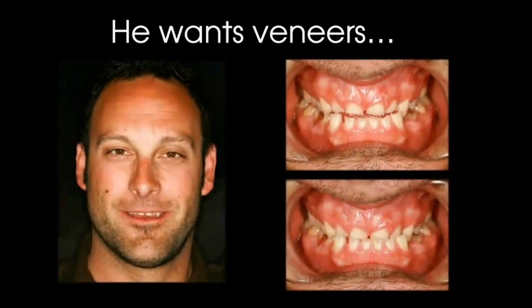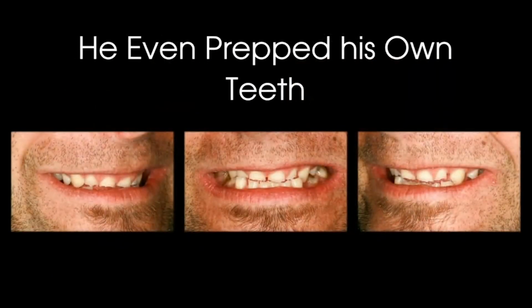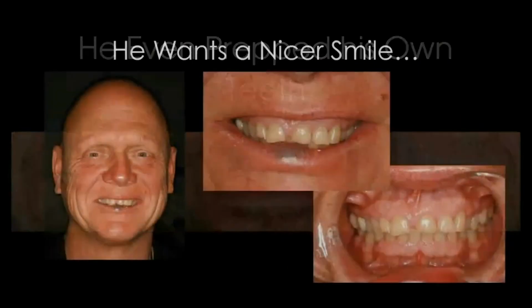He wants veneers. So he walks in, he's going to get married soon, in time for his sister's wedding. And he says, I want veneers. And I think he's even prepped his own teeth because there's not a lot of tooth structure left. How are you going to manage that?